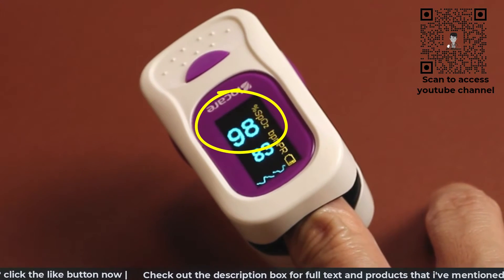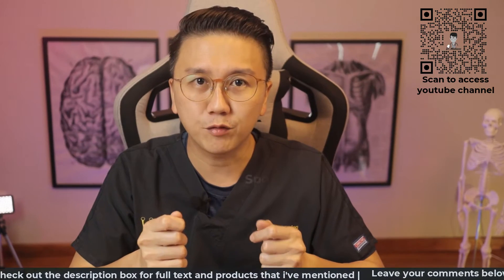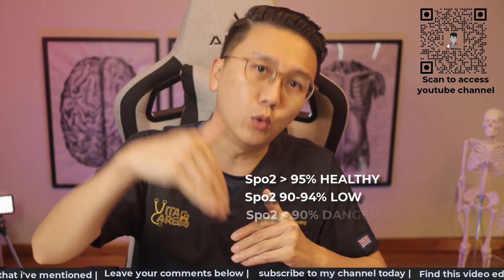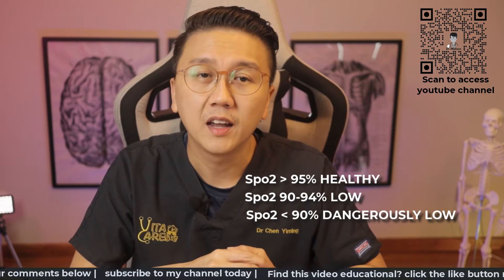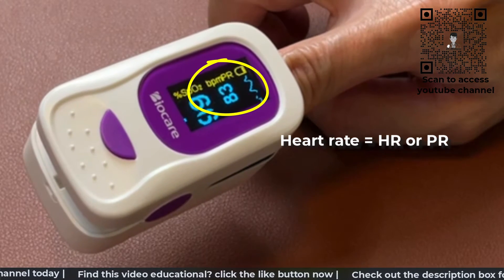The blood oxygen levels are displayed as SpO2 on the device. Blood oxygen levels of 95% and above are considered healthy. Levels between 90 to 94% are low, and if it drops below 90%, it becomes dangerously low. The heart rate is displayed usually as HR or PR.